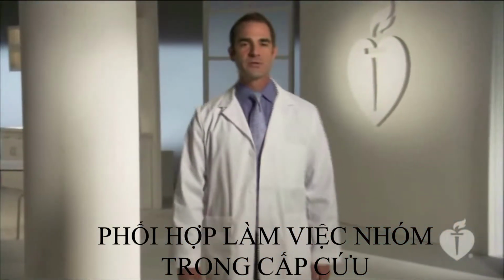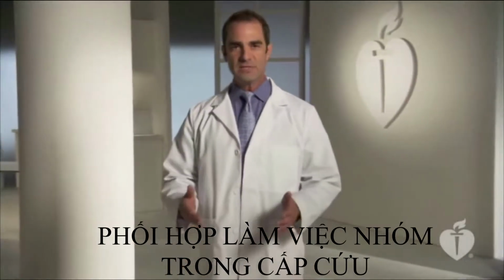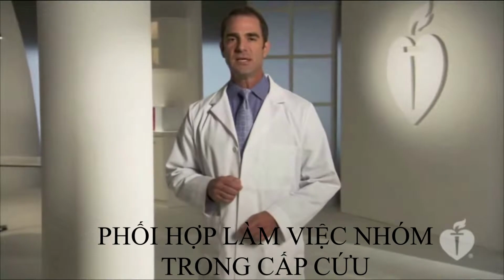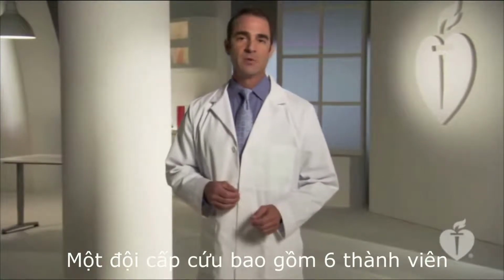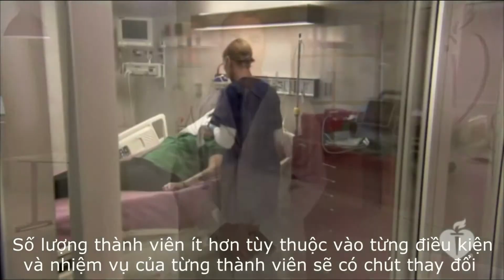Welcome to the American Heart Association's Megacode and Team Resuscitation video. In this video, we're going to demonstrate and model an effective resuscitation team in a case scenario. Our simulation will have 6 team members. You may have fewer members depending on the situation, so be prepared to adjust your roles accordingly.